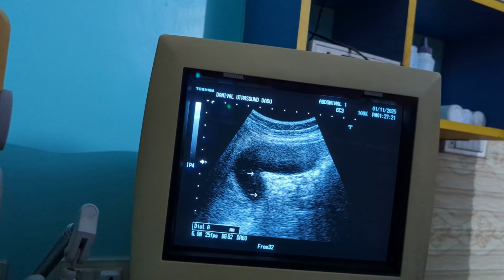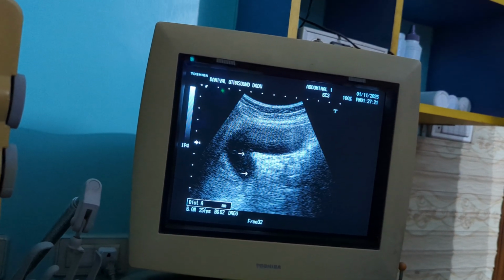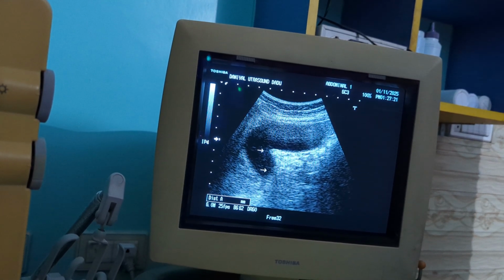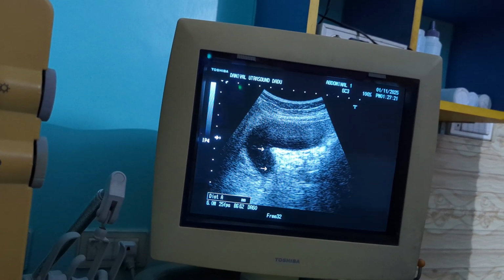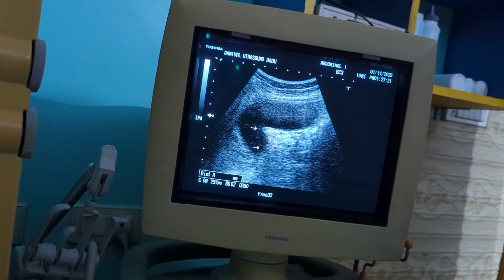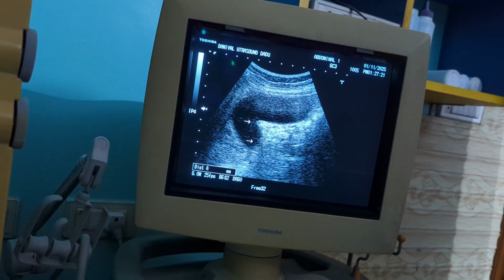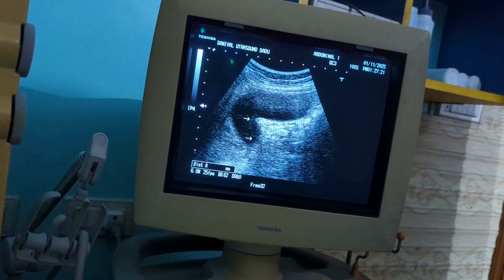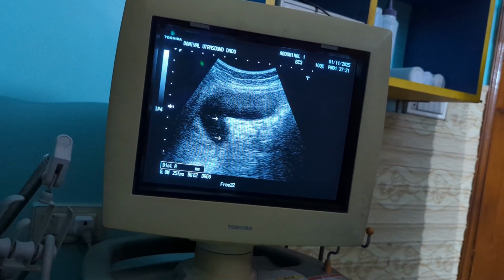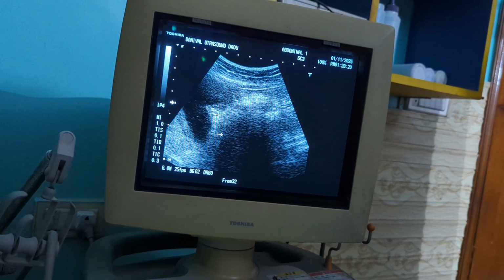So this can be labeled as gallbladder stones. There are two free gallbladder stones in the lumen. One of them has lodged into the gallbladder neck or cystic duct area, which is causing obstruction, partial or complete. And there are also signs of cholecystitis with slight streaks of pericholecystic collection, and this may be labeled as a hydrops of the gallbladder when the distension is marked and the bile appears clear and anechoic. But here the bile is not very clear. It contains a few internal echoes which are free floating.